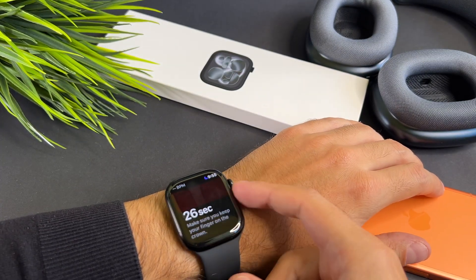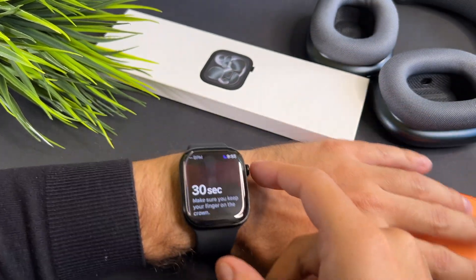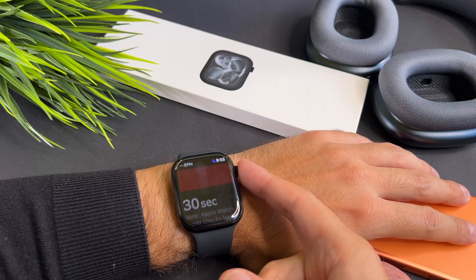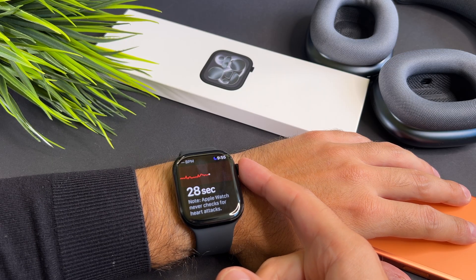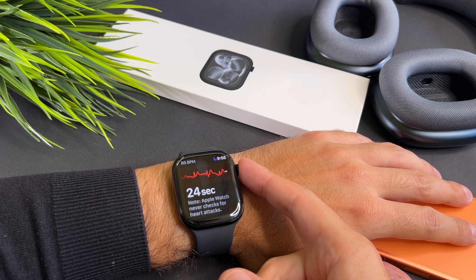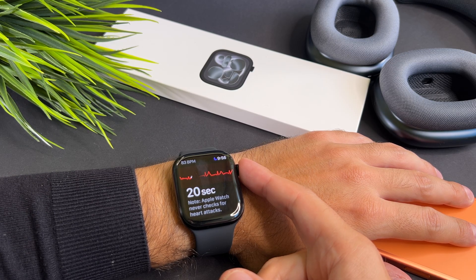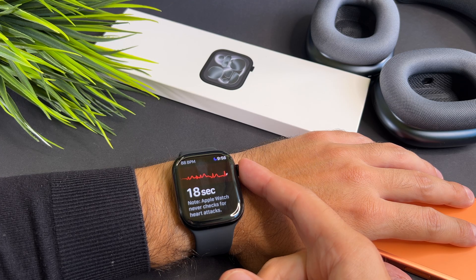It is important to mention that you must not move your wrist or your finger for half a minute. Otherwise you will need to start the process again, or you won't receive accurate data. Now put your wrist on the table or on your lap and don't move your finger.